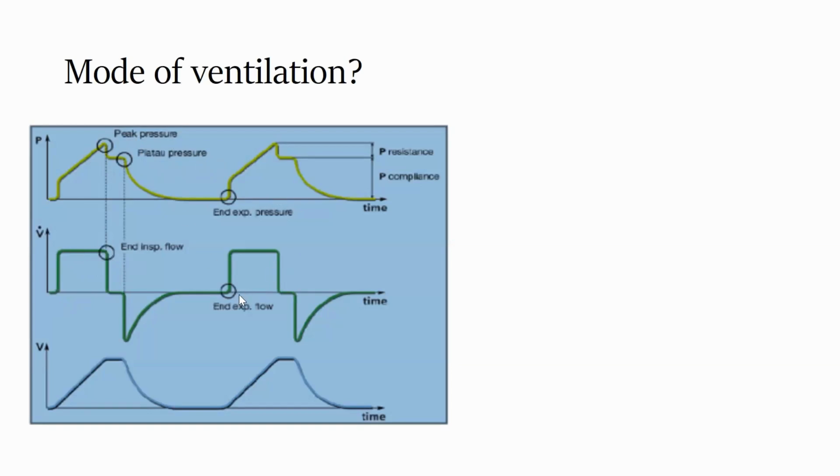If you see the volume time curve as well, there will be a flat stop, a plateau, because of the stop in the inspiratory phase. There is inspiratory hold, and this inspiratory hold will hold the flow time curve as well, and will also hold the volume time curve.